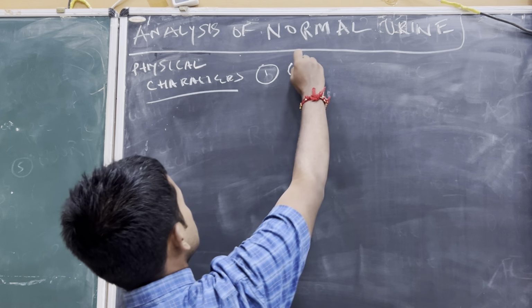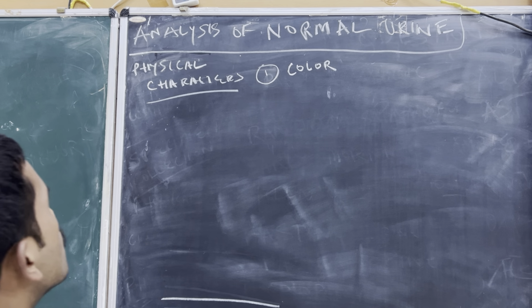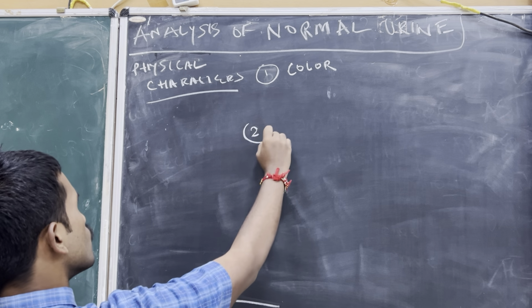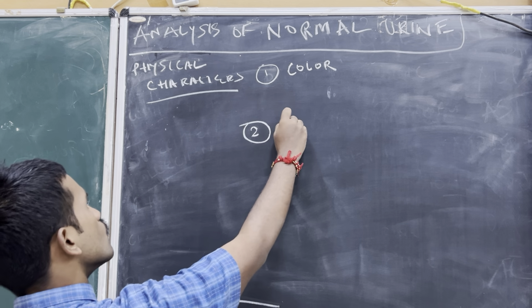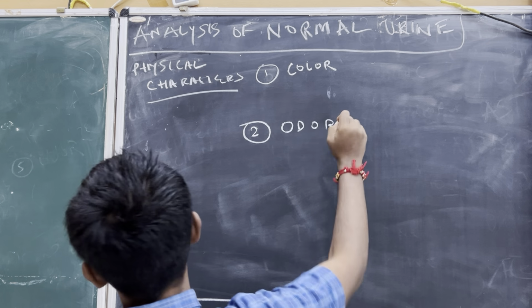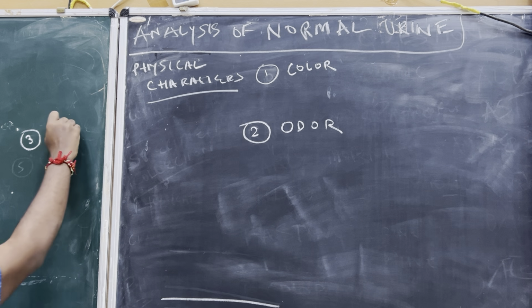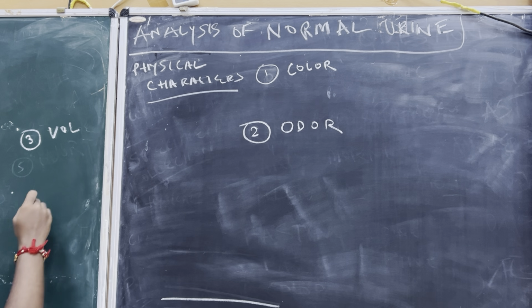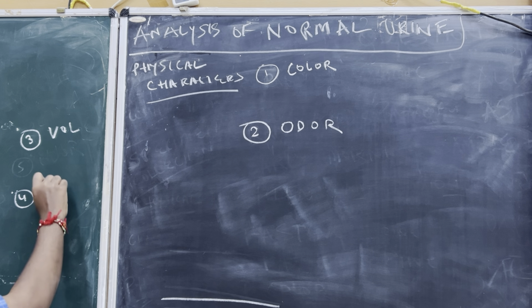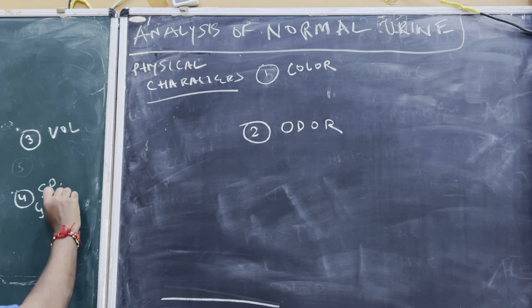We have color, odor, volume, and specific gravity.